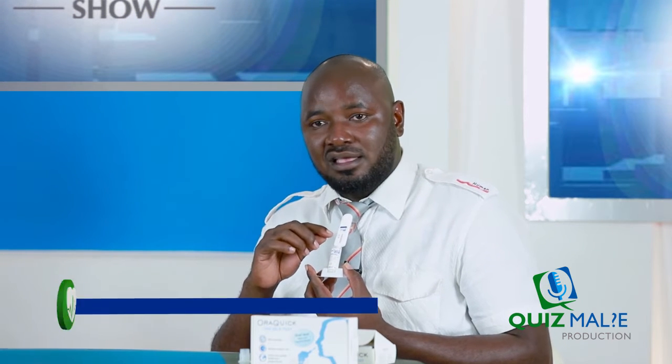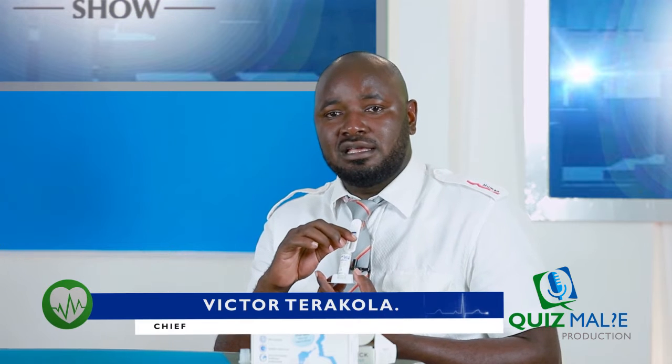For any valid test, there should be a line that appears against the C. So that means that your test is valid, your test is working well. It's a control line.